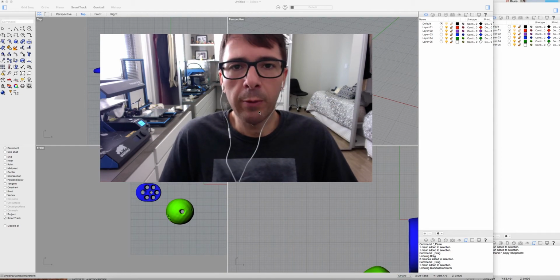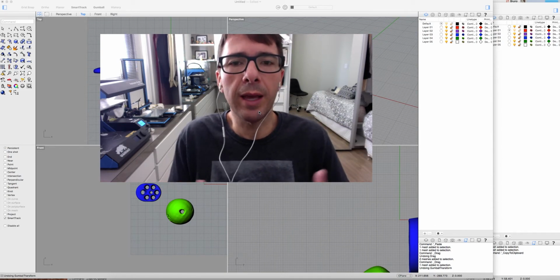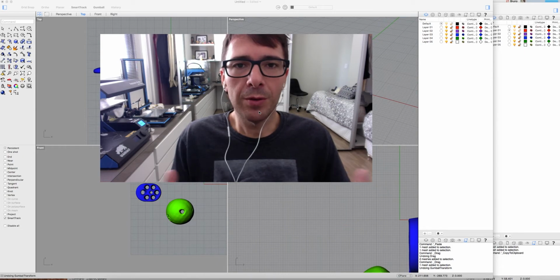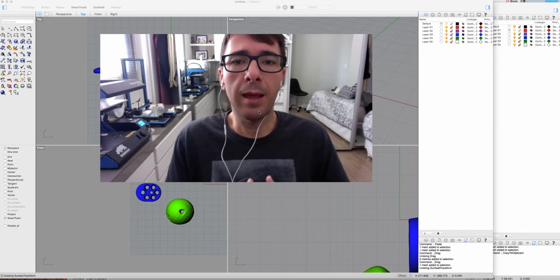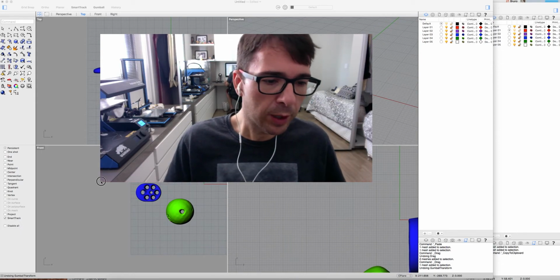These student request videos we record in a more not professional way. We try to be as quick as the students have doubts, so we do not edit this video. So we're going to show in this video how we can draw and design an implant using a 3D file. Okay, I'm going to show here.